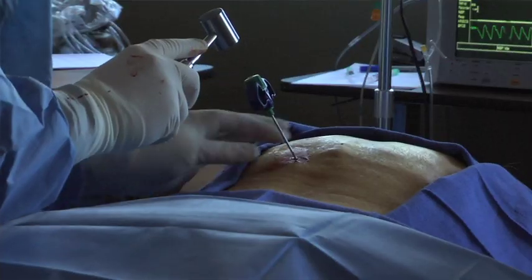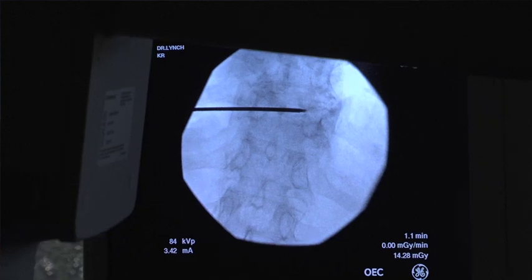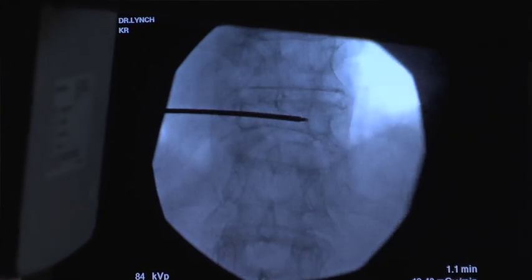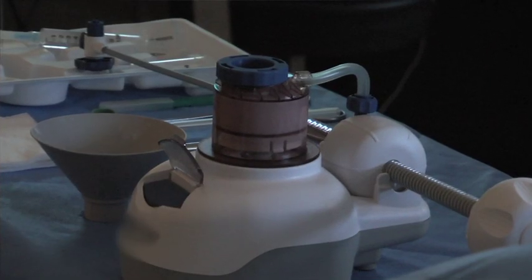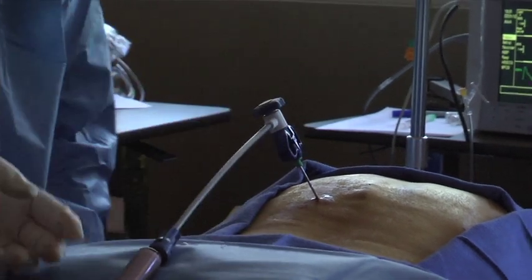The trocar or needle is advanced to the anterior one-third of the vertebral body. This is the perfect location to begin the delivery of cement. When the correct position of the needle is visualized on x-ray, methyl methacrylate, or bone grade cement, is placed through the needle.